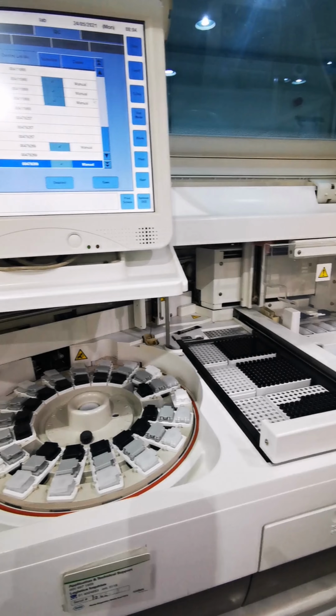On the number 3 position, we shall put the stop tube. The stop tube has a barcode on it, and when the machine scans it, it means that the test is only for the number 1 cuvette and number 2 cuvette, and on the number 3 cuvette, the machine has to stop scanning for samples.